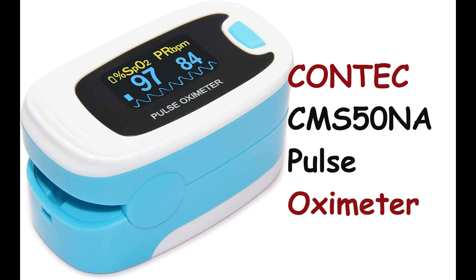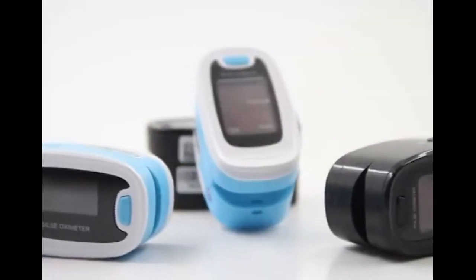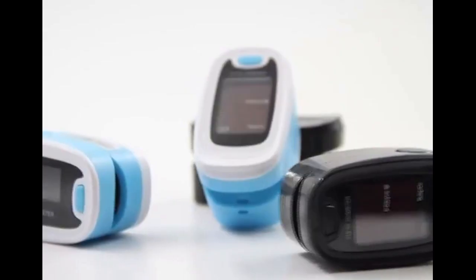Context CMS50NA Pulse Oximeter — SpO2 and PR value waveform, blood oxygen, neck/wrist cord. About this item: accurate and fast results. It measures accurately and quickly SpO2, blood oxygen saturation of arterial hemoglobin levels, and pulse rate.